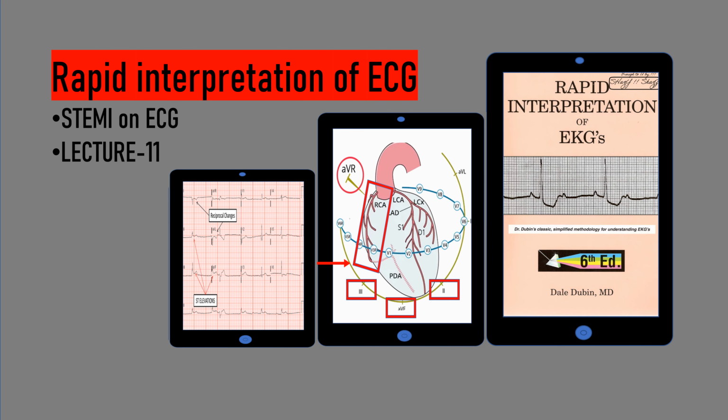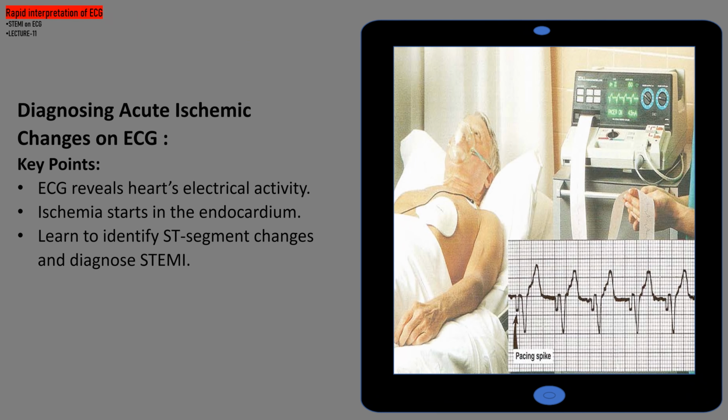Welcome to our 11th video in Rapid Interpretation of ECG series. Topic of today's video is acute ischemic changes on ECG.